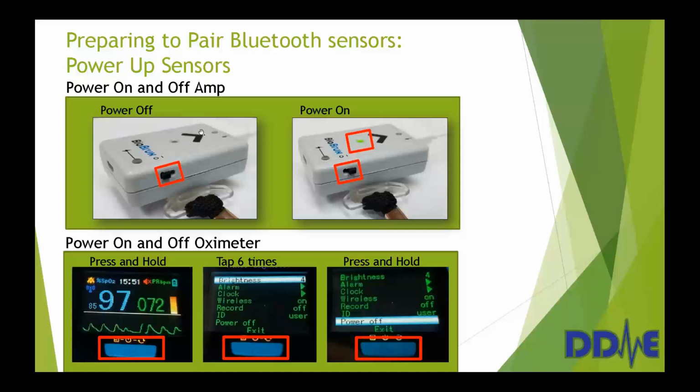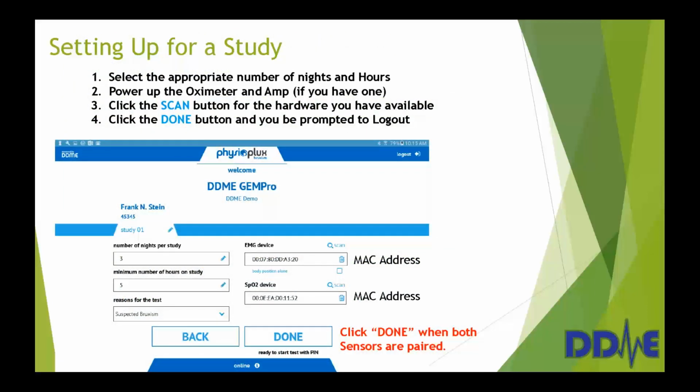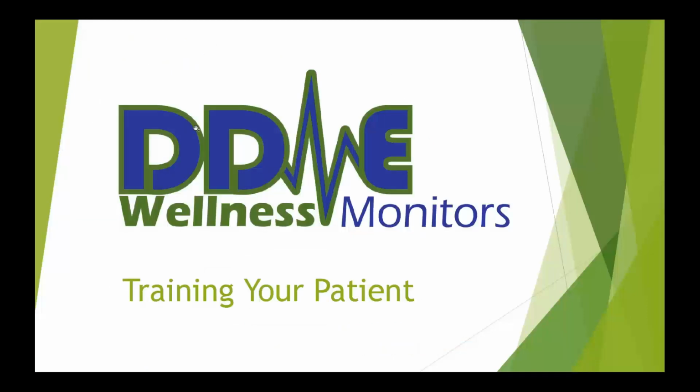Okay? All right, so once you've clicked done and the sensors are paired, we're ready to hand the tablet over, or the GEMPro over to the patient. So now we're going to transition to how do you present doing a GEMPro study at home to your patients.